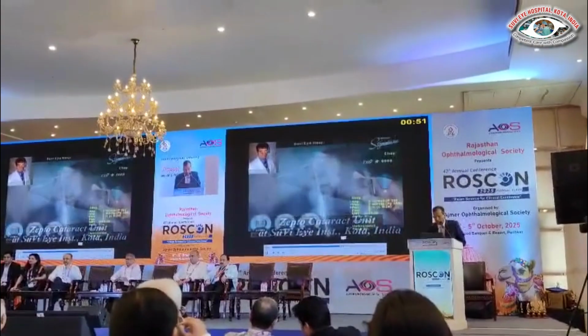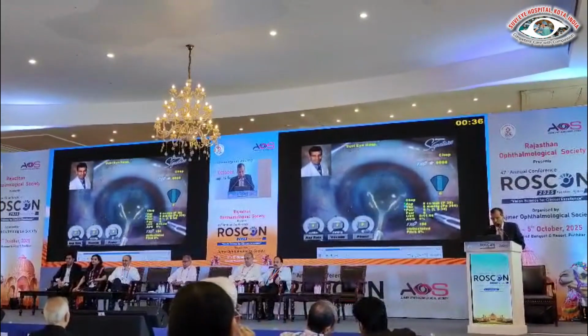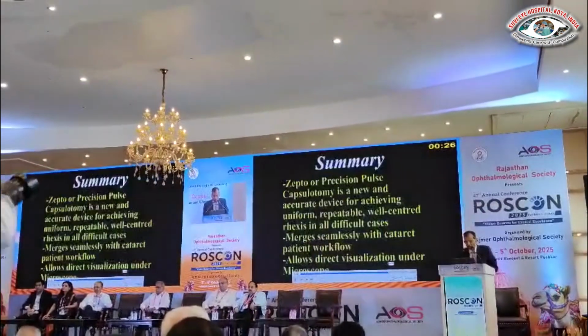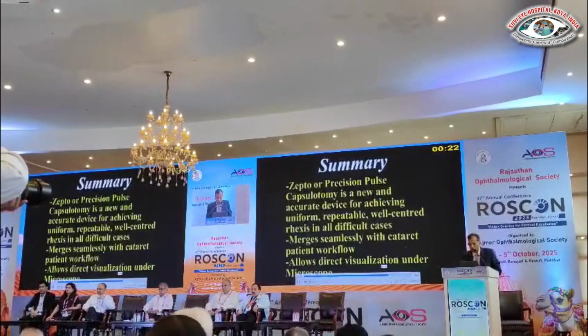So this is another case of hypermature Morgagnian cataract, and this is the third case I am going to show you. Here the device is inserted into the anterior chamber, followed by creation of successful capsular access using the Zepto nanopulse technology. You can see there is cortical milk, but the access is done successfully. And this is my last case, where the access was done in a small pupil case.